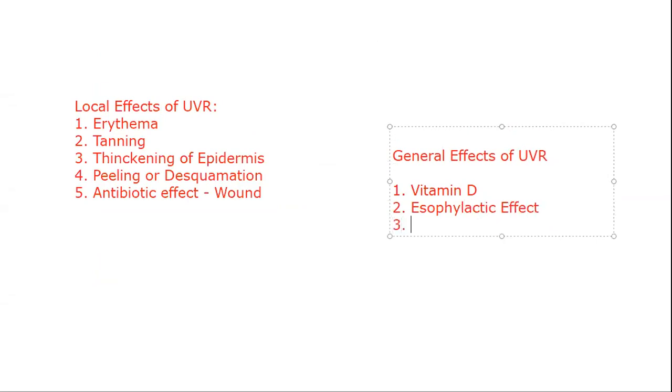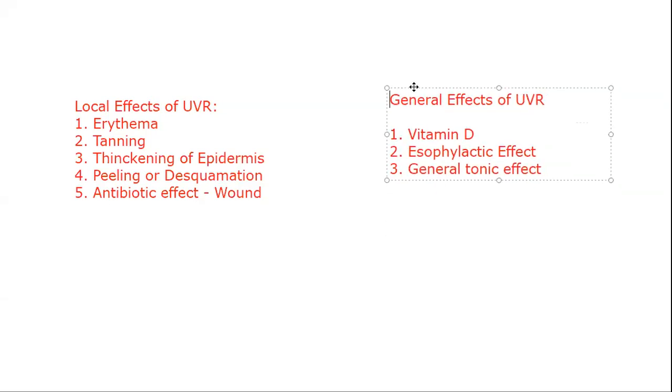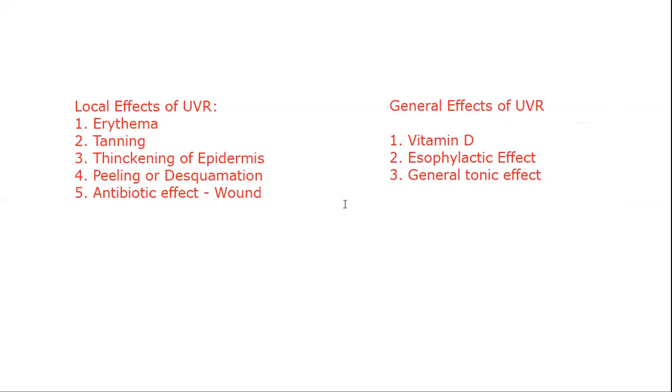Third one is your general tonic. So these are very important physiological effects. These are the physiological effects of UVR.